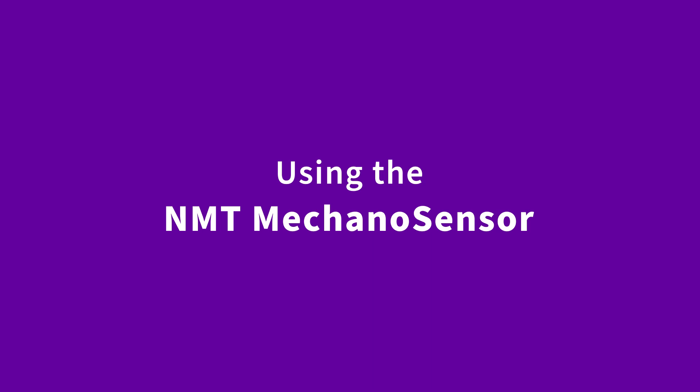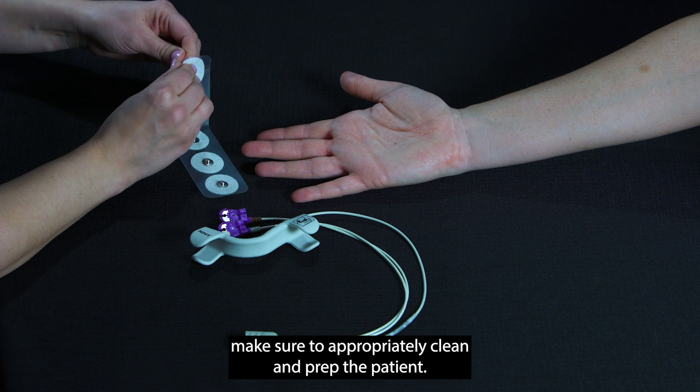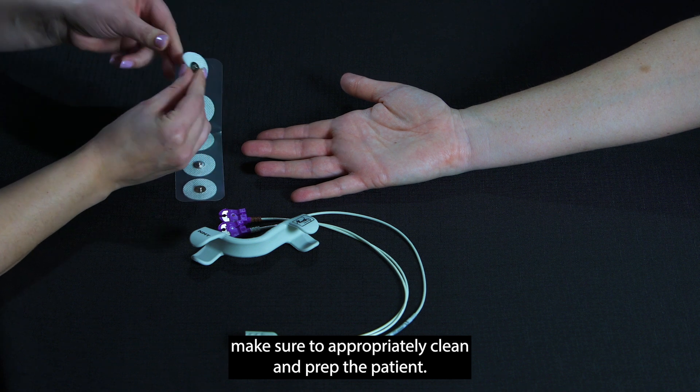Using the NMT MechanoSensor. Before applying the NMT MechanoSensor, make sure to appropriately clean and prep the patient.